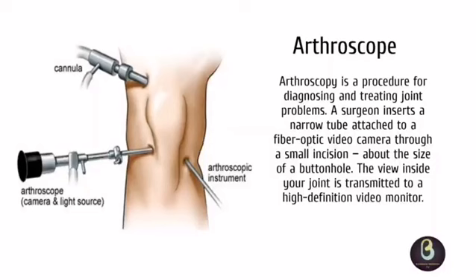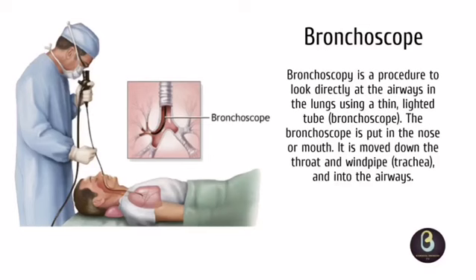Arthroscope, used to examine intra-articular surfaces of joints. Arthroscopes are rigid and contain stacks of optical lenses, while the eyepiece is generally attached to a video camera. Due to the frequency of knee injuries, the arthroscope is most often used to diagnose and help treat knee damage. Bronchoscope aids in exploring the interior of the bronchi, their branches, and tracheal mucosa, the windpipe tissue lining.